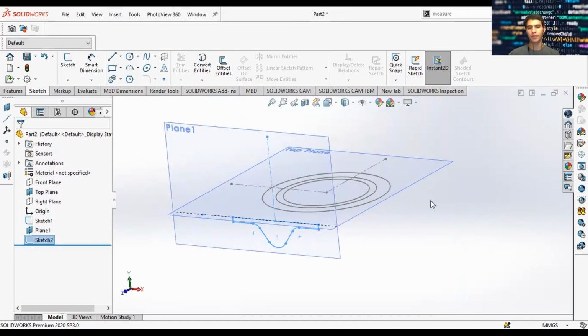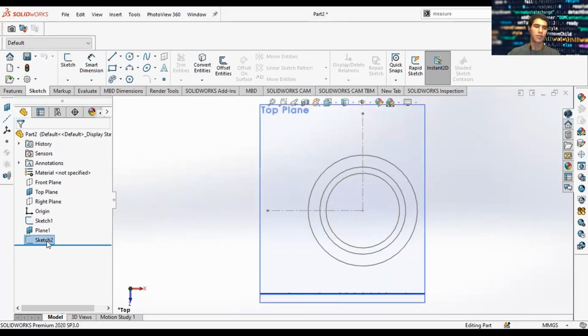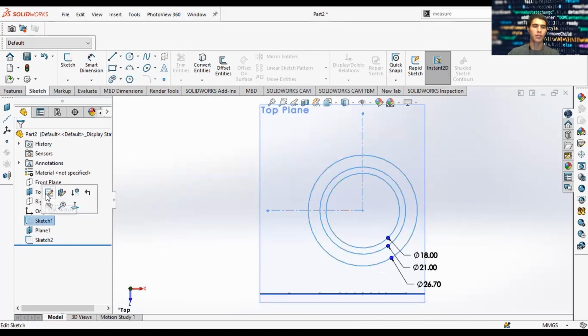So now we have our side view and our sketch here. Let's go ahead and go back to this sketch. We're going to edit this again. And let me introduce you to the rollback feature on the family tree. This here to your left is called a family tree. It basically shows you the progression of your entire model from beginning to end. So our first item that we added was a sketch. We're going to go back and edit the sketch, or if you want, you can roll back the feature and suppress everything else until you only have the sketch. So I'm going to go back here, click edit sketch.